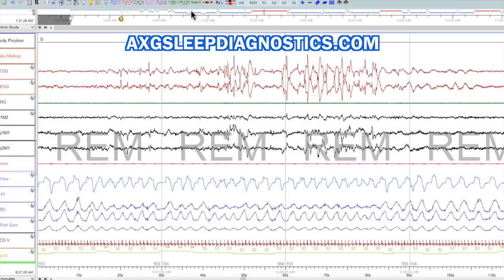It looks like there was one little thing right there. Now, if you march it out again, a REM period should be occurring every 90 minutes. And that gets us to right here, where this is a REM period. So about every 90 minutes, you should be seeing something kind of funky. You'll see some funky breathing. It's 90 minutes out from your sleep onset, and then every 90 minutes thereafter, and you don't know how long it's going to last. But if you start seeing goofy breathing, don't automatically think, oh my God, there's something wrong with me. It's probably just REM.